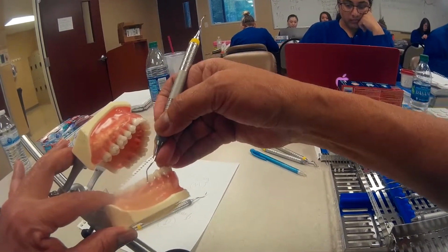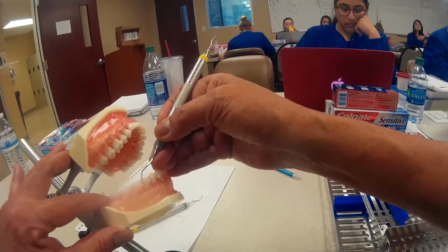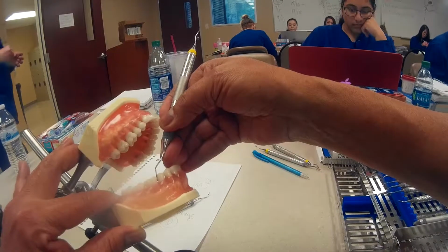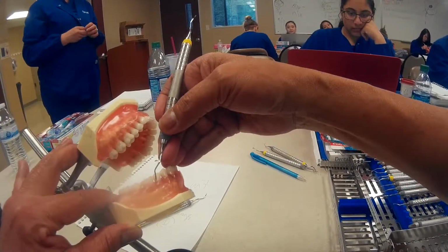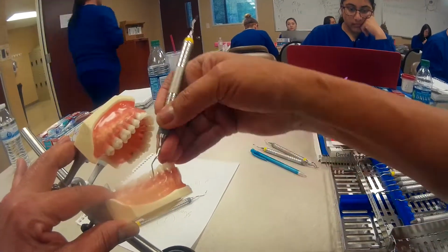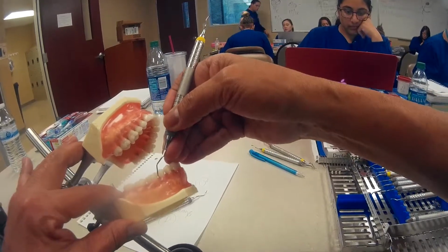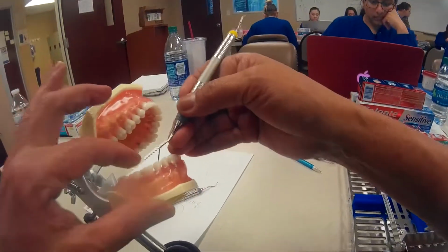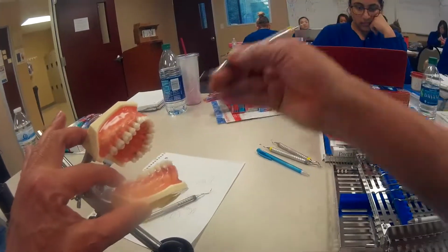And as you go into the straight distal, just remember, sometimes when you get stuck, I see sometimes you'll get stuck like this. And what happens when you're stuck and your instrument flies off the tooth, it's because maybe you're adapting more than that third tip, and then you can't get out of there. So, again, making sure that you're pivoting correctly so that you're adapted, and then you just pull out very undramatically without flying off like this.